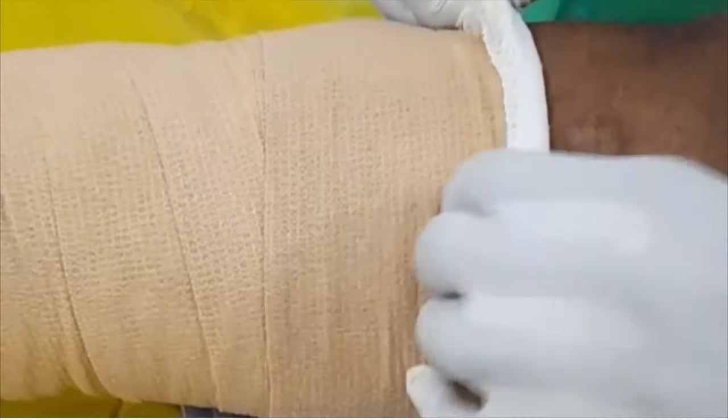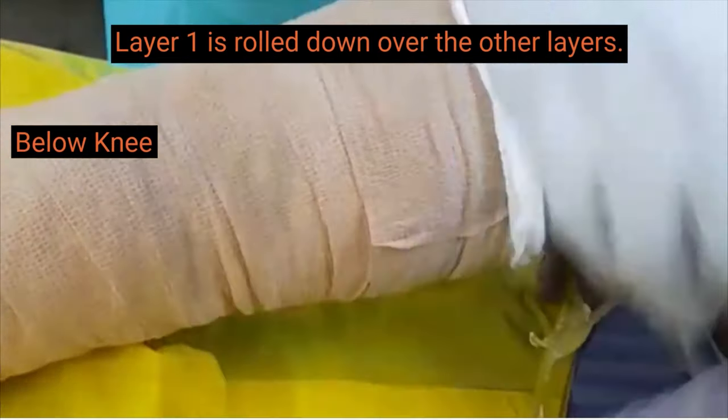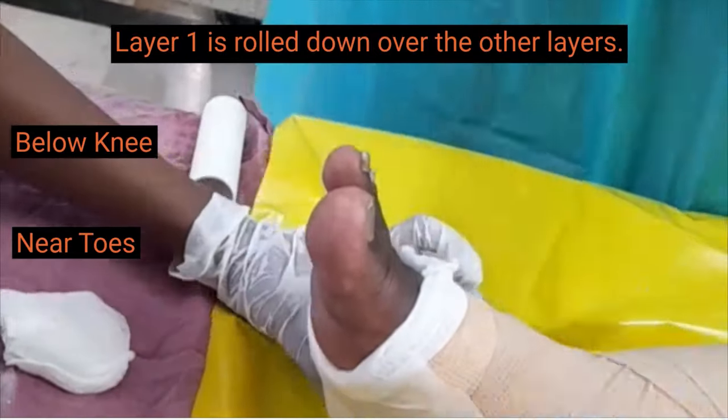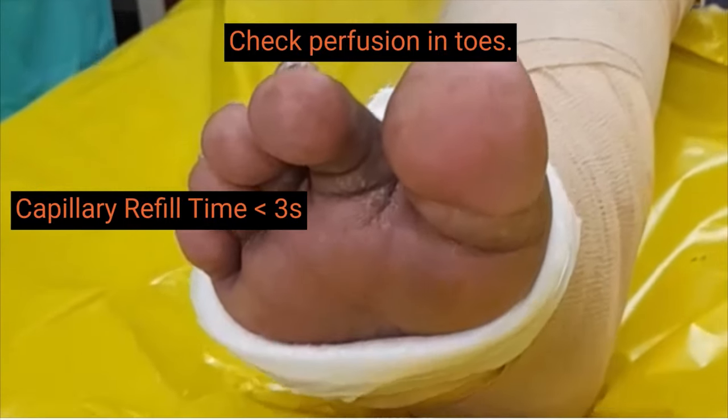The first layer is rolled down on the other layers to avoid injury to the skin due to compression bandages. The first layer is checked at the end of the procedure.